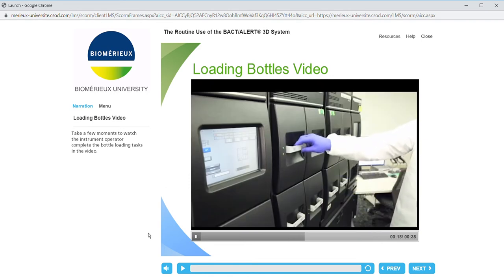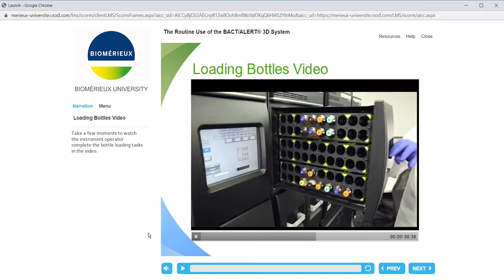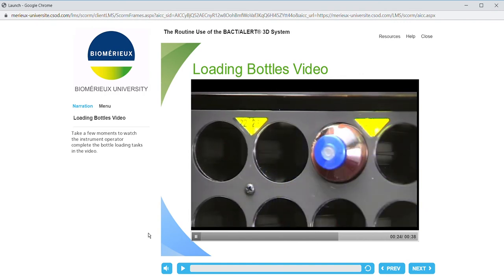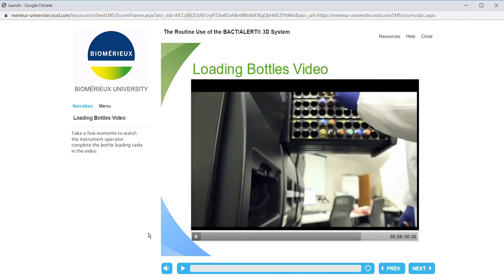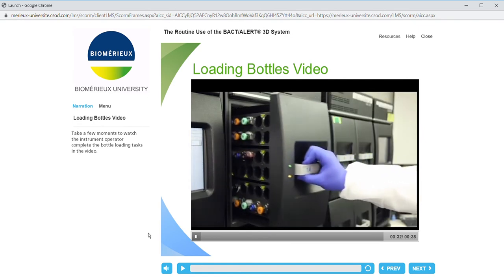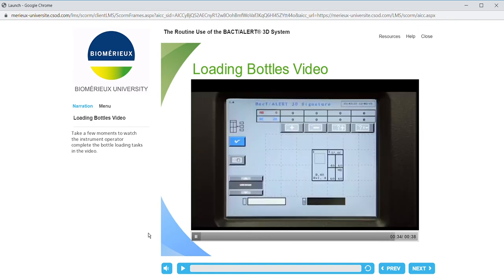Open any drawer with an illuminated green light. Load bottle into any empty illuminated cell. Note: handle bottles one at a time. Repeat until all bottles are loaded. Close the drawer after all bottles have been loaded. Press the check button to return to the main screen.